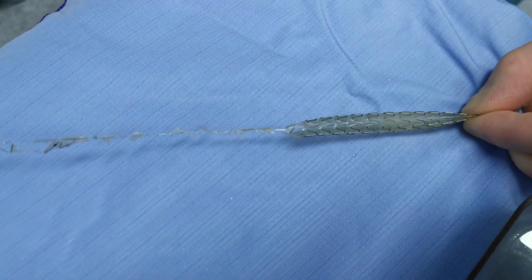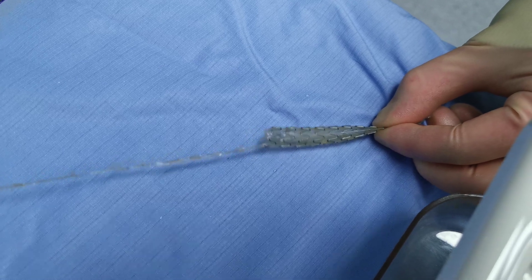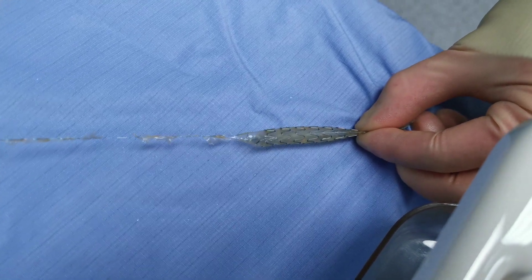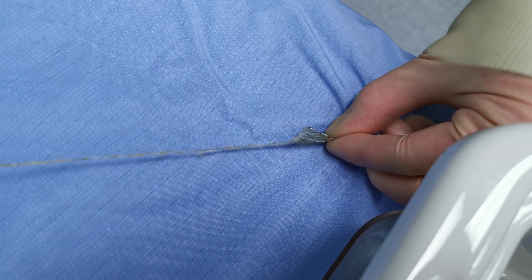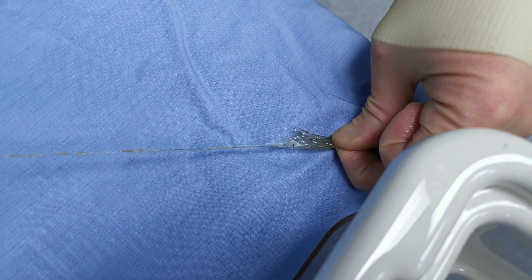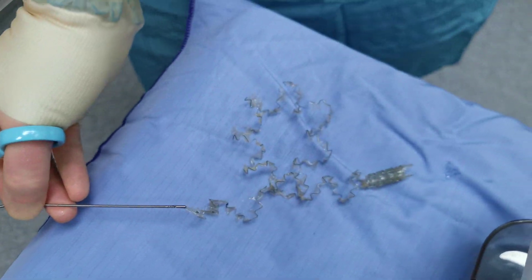You can see it's one long length of nitinol and the plastic comes with it — that's how it would normally come out through the urethra. And that's the Allium stent fully unravelled; that's what you're left with at the end.